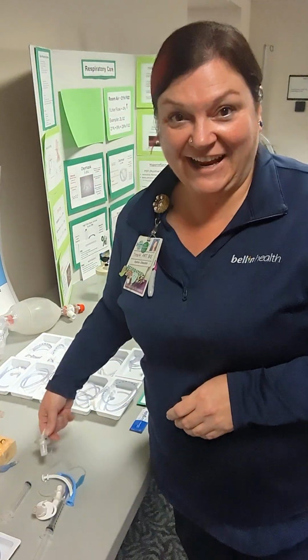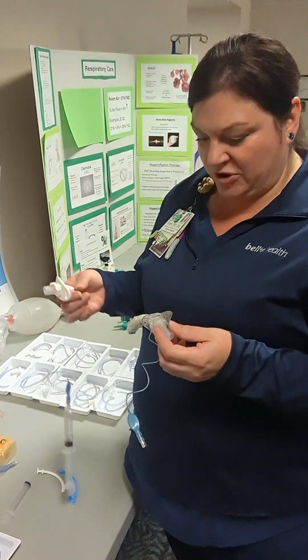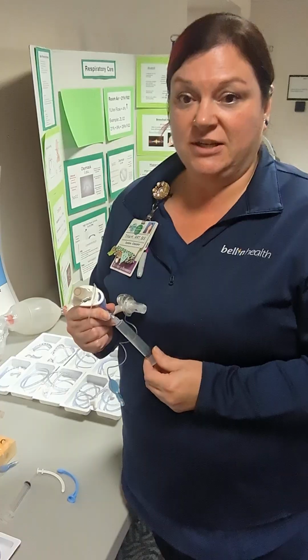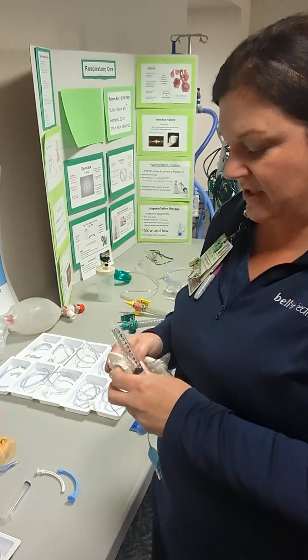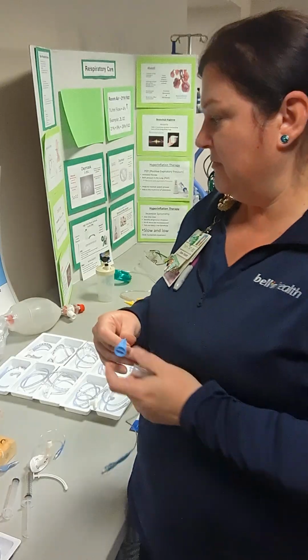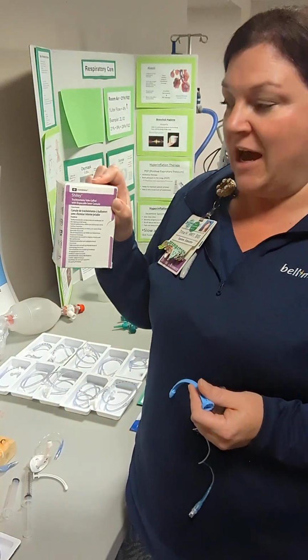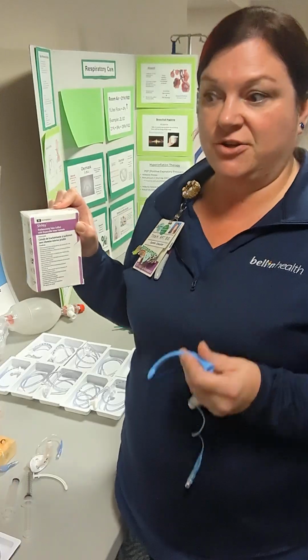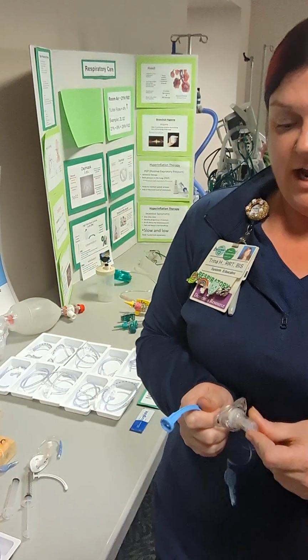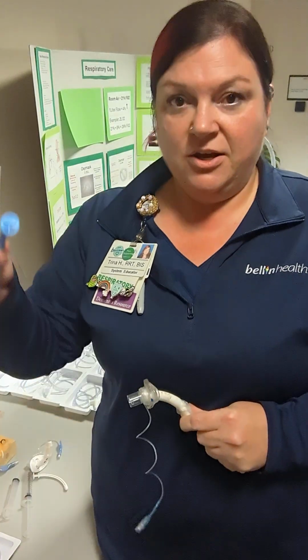Okay, then last thing, we're going to talk about trachs. So we've seen a lot more trachs recently, and I just wanted to review a few of the different components when we get a trach. So this is what it comes in, this little box, and when a patient goes to surgery, there are 3 things inside of this trach box. You're going to have the airway itself, that's the trach.